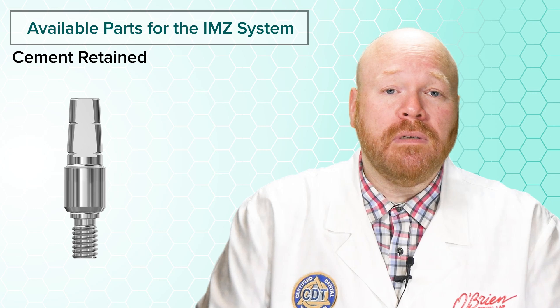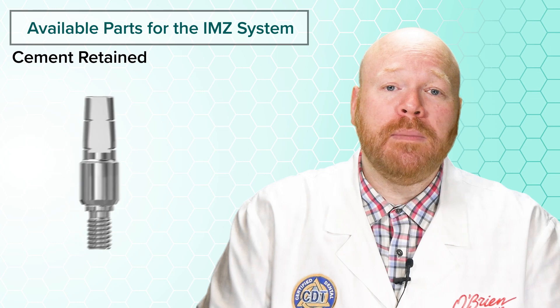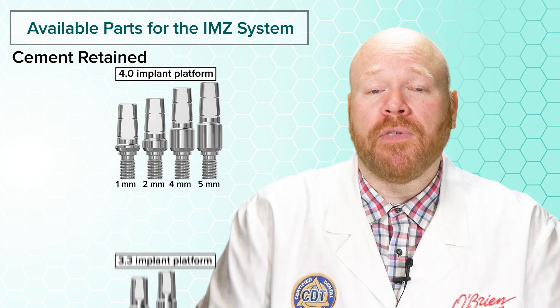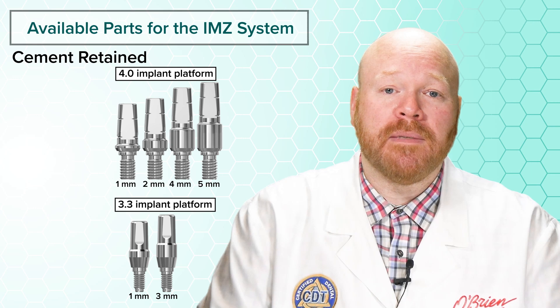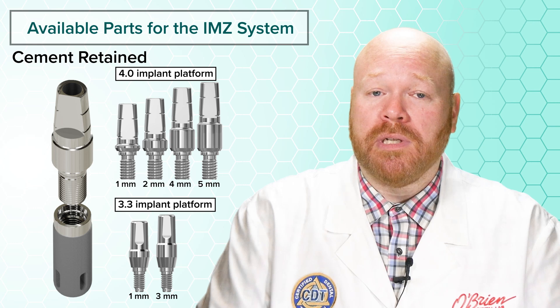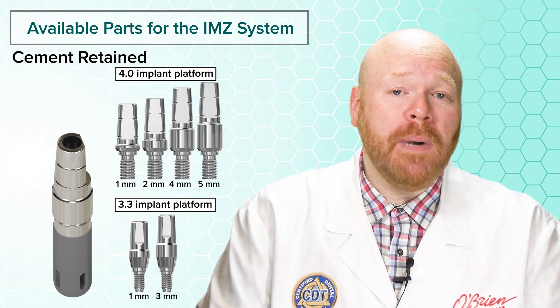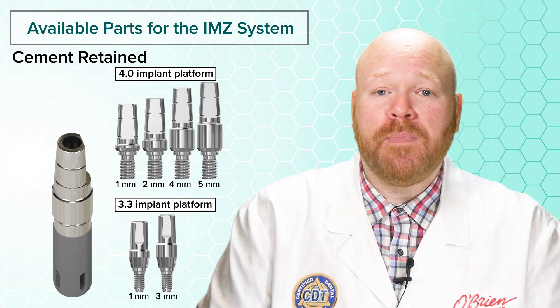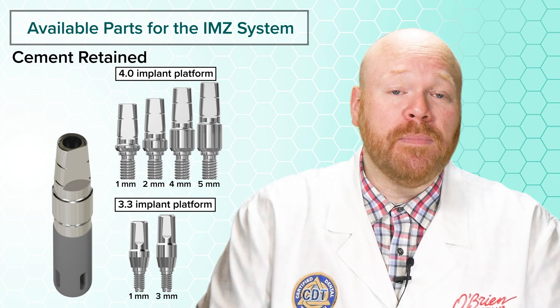The abutments are cylindrical with one flat side and a uniform margin height. For the 4.0 implant, it's available with margin heights of 1, 2, 4, and 5 millimeters. And for the 3.3 implant, it's available with just two margin heights of 1 and 3 millimeters. These abutments have integrated screw threads instead of a separate screw, so when you place these in the implant you'll be rotating the entire abutment to screw it into place. They also don't have thread timing, which means that every time the abutment is rotated into place, that flat side could be in a different position.